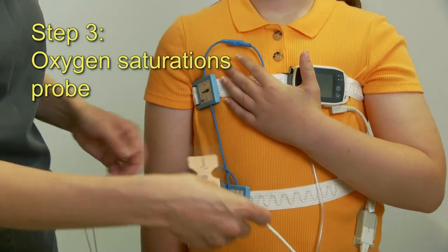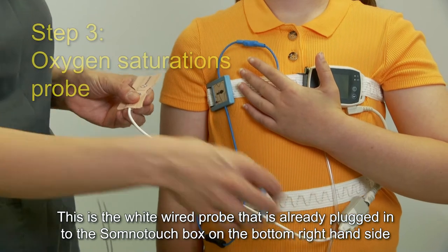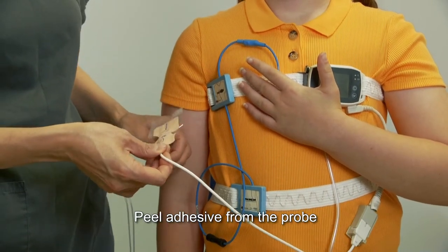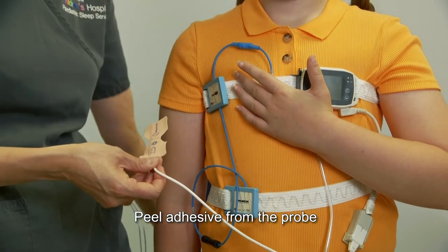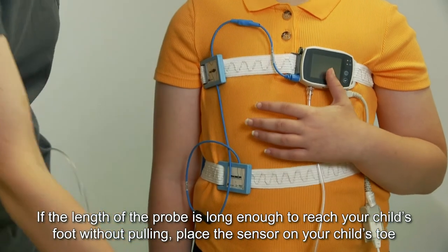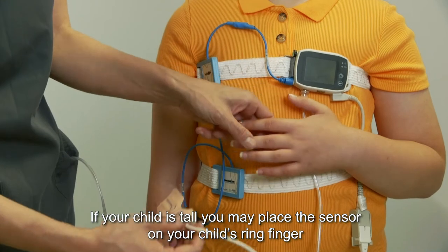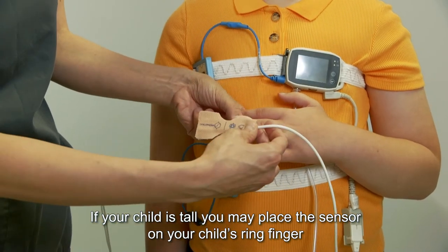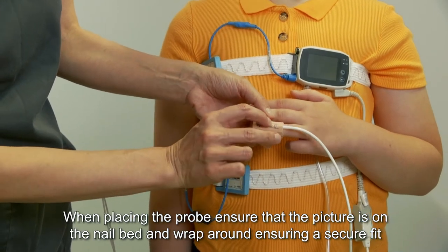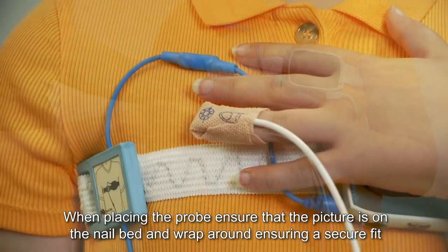Step three: oxygen saturations probe. This is a white wired probe that is already plugged into the SomnoTouch box on the right hand side. Peel the adhesive from the probe. If the length of the probe is long enough to reach your child's foot without pulling, place the sensor on your child's toe. If the child is tall, you may place the sensor on your child's ring finger. When placing the probe, ensure that the picture is on the nail bed and wrap around ensuring a secure fit.